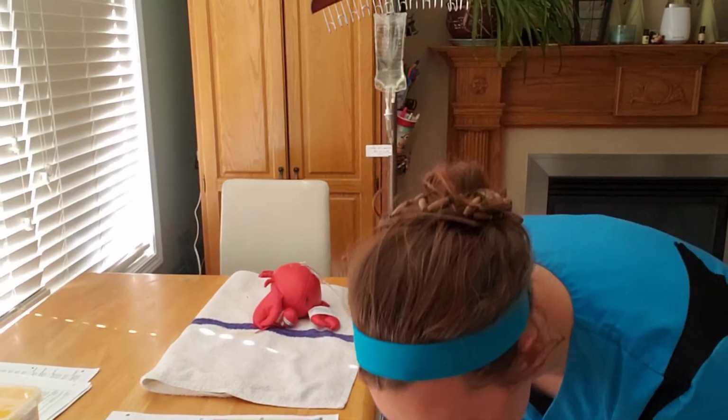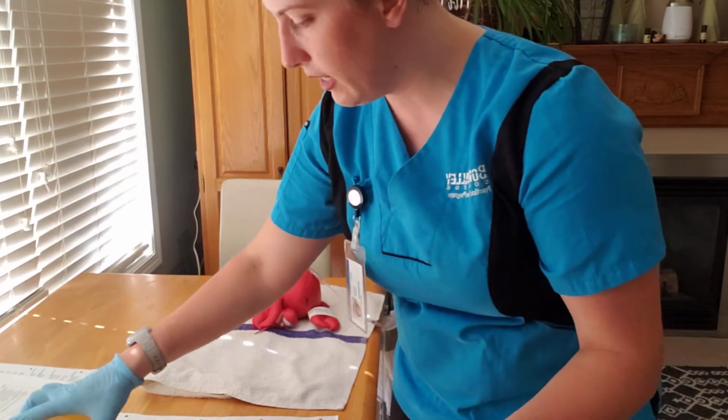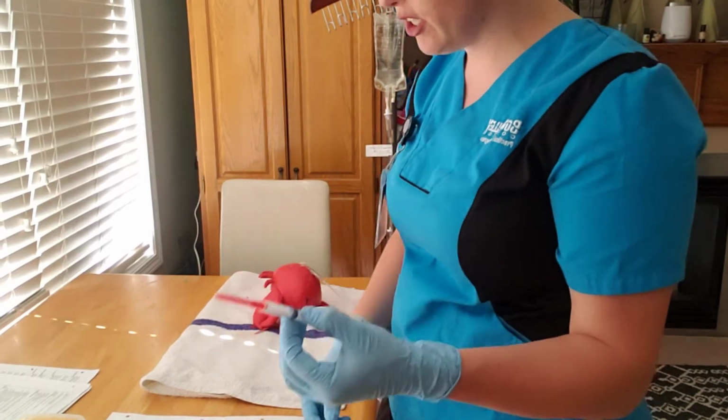Okay, just a little bit past. I'm just gonna put that in the garbage. Okay, using the scoop technique, I'm gonna recap my syringe. And now I'm gonna do my second check on my syringe itself.